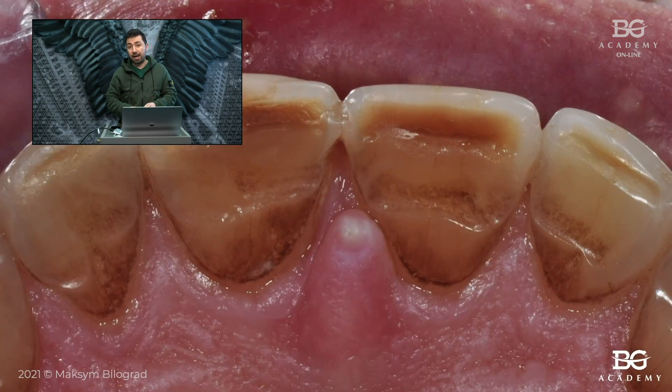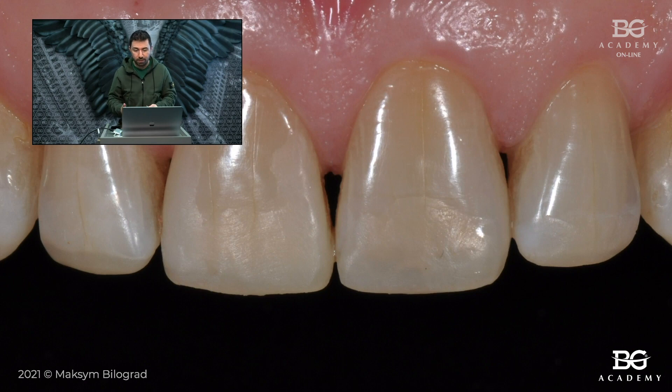From the palatal side you can see a more dramatic view and a very specific wear facets, which shows us the position of the lower jaw aiming to move slightly forward. I would like to mention that this is a full mouth rehab case because posterior teeth were even worse and we made a full mouth reconstruction. All was released in CR position, but today I will be focusing mainly on anterior crowns. We made a freehand direct mock-up just to understand the length of frontal teeth, which helps us to evaluate aesthetics.